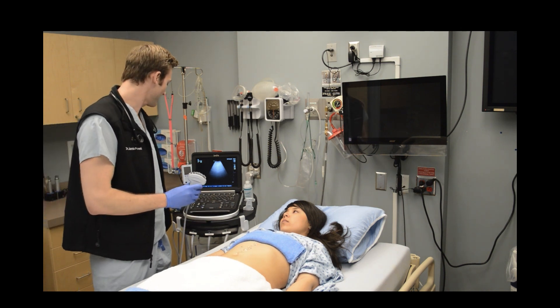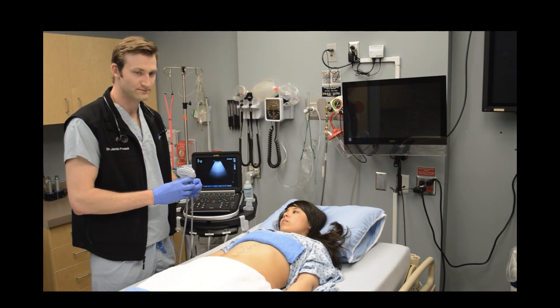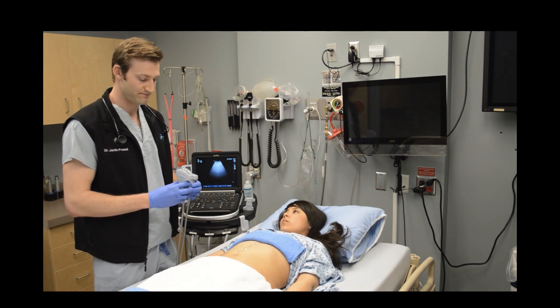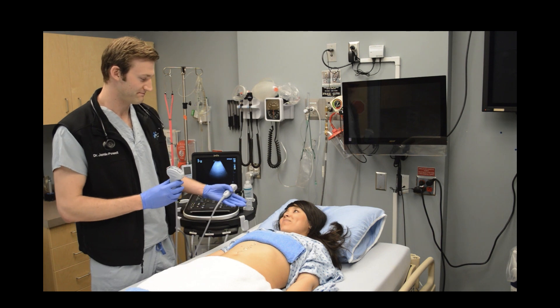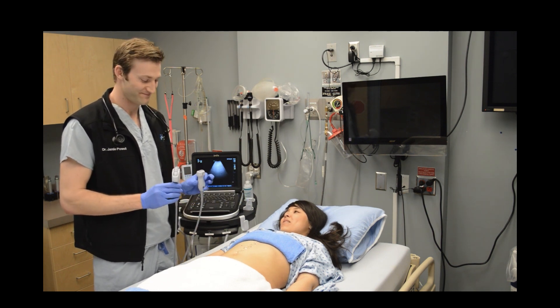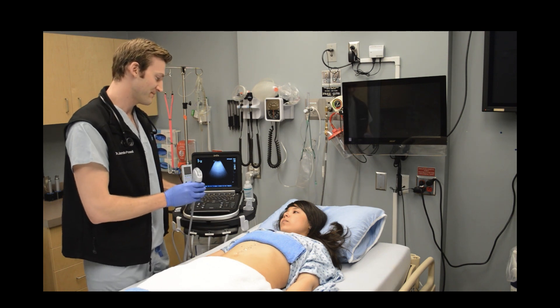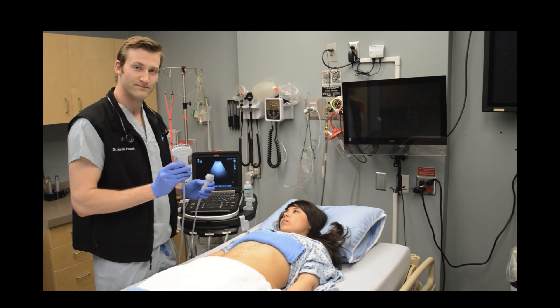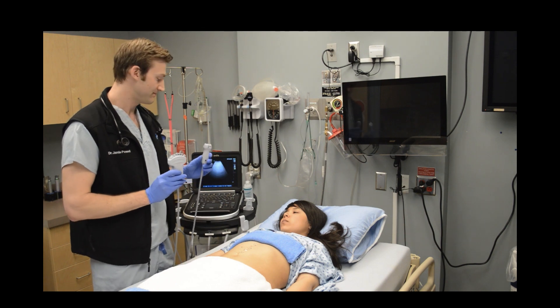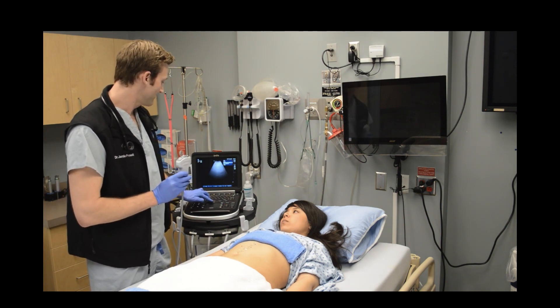In this part of the video, I'll show you how to obtain optimal views to look for pericardial fluid. Stephanie is our healthy volunteer. The subxiphoid view is often the only access point we have during an active resuscitation. The scan is done with the low-frequency curved array probe or the cardiac or phased array probe. Use the cardiac presetting if available.